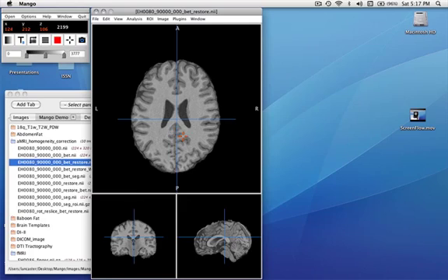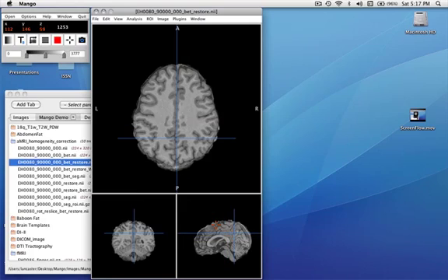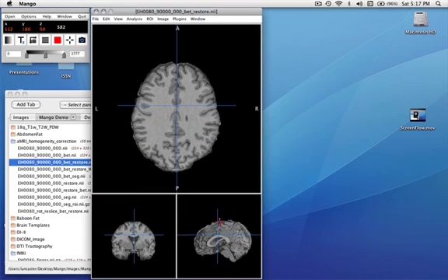As we move the cursor around through various images, we see that the X, Y, and Z change. These are actually row, column, and slice locations within this image.